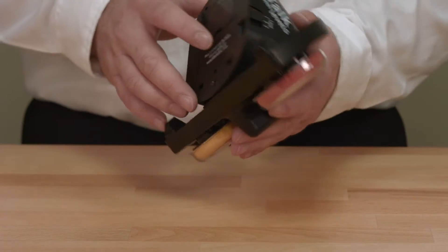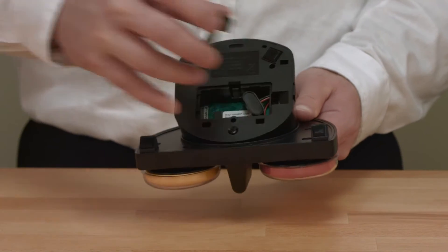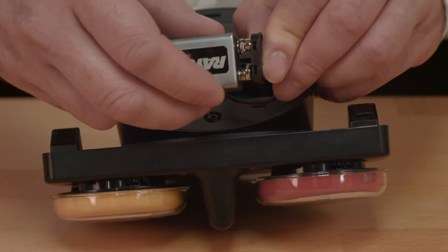The setup of the iTalk 2 with Levels is easy. Before getting started, insert a nine-volt battery into your device. The battery door is found on the bottom of the device. Once the battery is installed, you are ready to begin recording your sequence of messages.